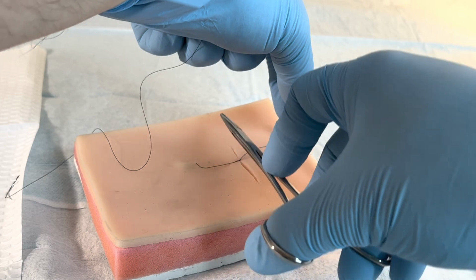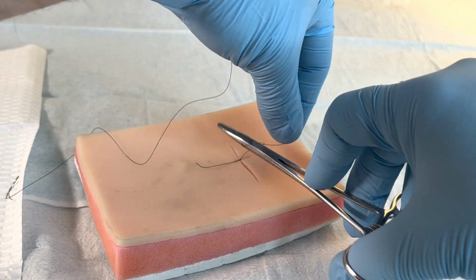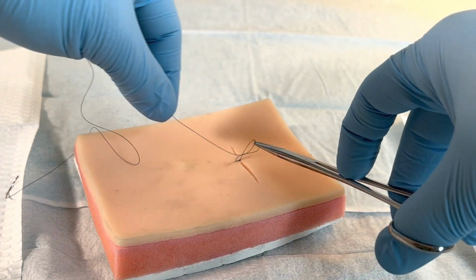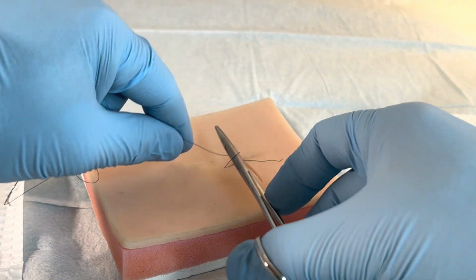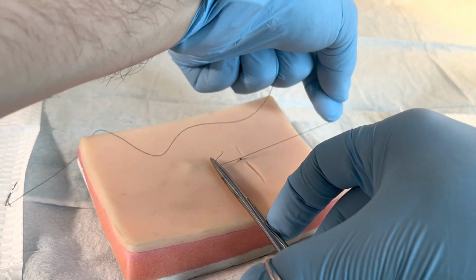Instrument, parallel to the wound, over the wound. Lead edge throws over the instrument. Grab the tail. Pull through, and arms switch sides. One more for good measure. Instrument over the wound, 1 throw over the wound. Grab the tail. Arms pull through, and switch sides.